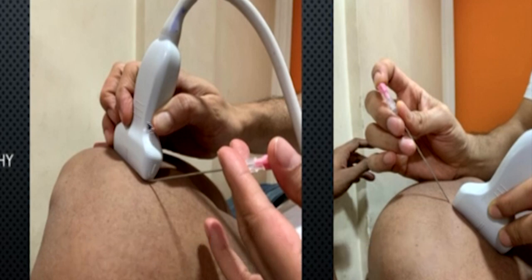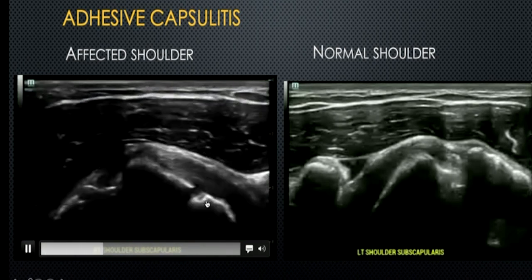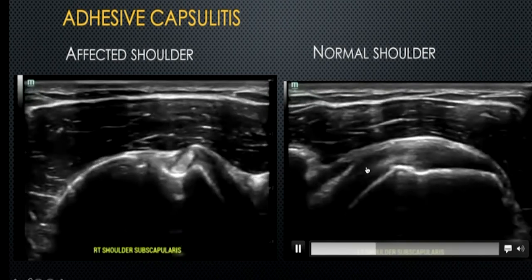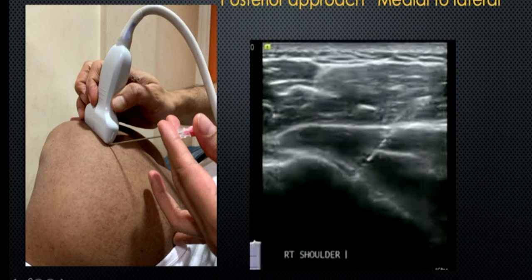For shoulder joint injection, you can give the joint injection either medial to lateral or lateral to medial. Try to be ambidextrous — able to do it with either hand. These are typically done in cases of adhesive capsulitis, labral tears, or inflammatory arthropathies. In adhesive capsulitis, movements are restricted — external rotation is restricted so the subscapularis only comes out to the one o'clock position, whereas on the normal side it comes all the way to three or four o'clock. In such cases, take the needle all the way under the probe through the infraspinatus into the posterior superior glenohumeral recess.